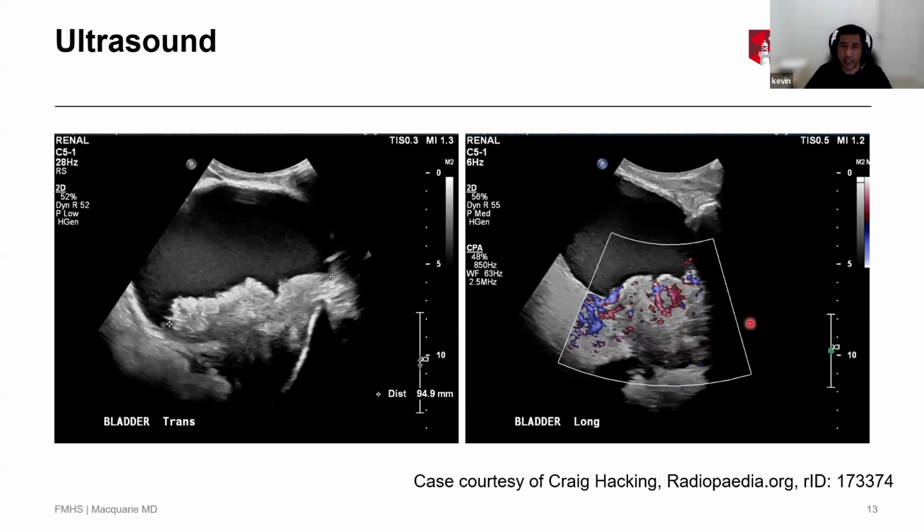And the other problem is that if the bladder is not well distended, you can get folds, or if there's bladder outlet obstruction, you can get trabeculation, and that can be sometimes ignored, or a bladder tumor may be ignored because they think it's trabeculation. So it's not a perfect test, but as a screening test, if it picks up a couple for free, I'm happy.